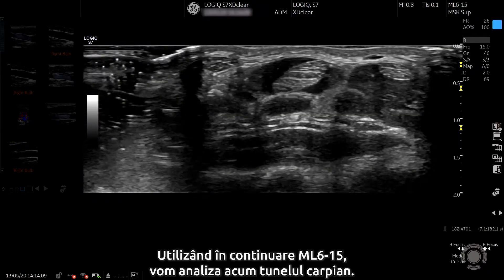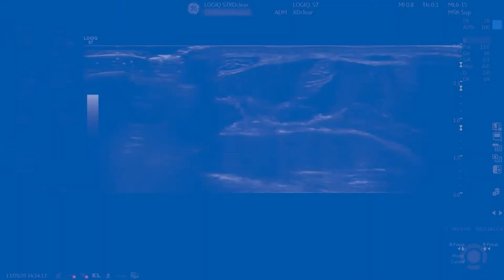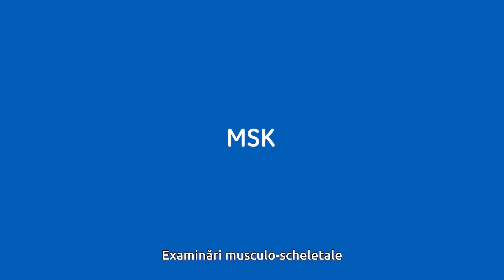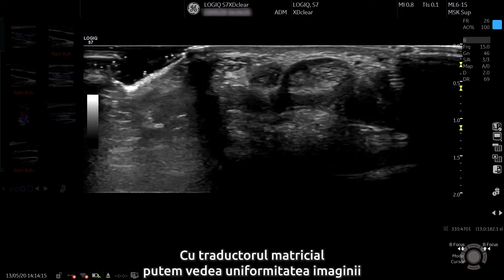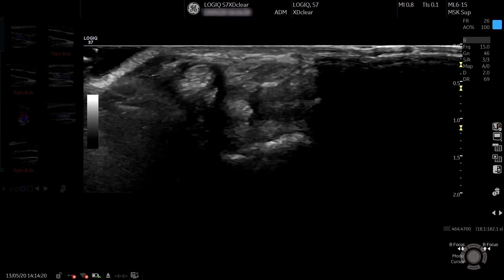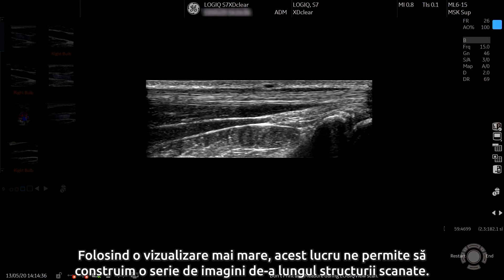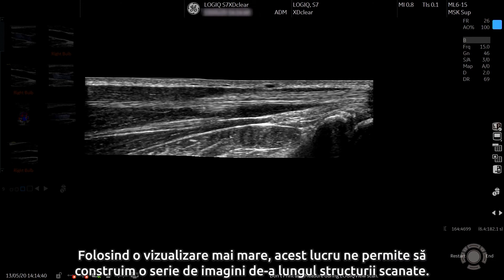Still using the ML6-15, we're now going to scan the carpal tunnel. With a matrix array transducer we can see the image uniformity from near to far field with good spatial resolution. Using Logic View, this allows us to build up a series of images along the structure being scanned.